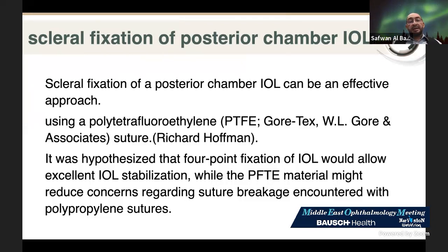And for this suture, I searched for the one who used it off-label, and the first one who published a few things around it was Professor Richard Hoffman. It was hypothesized that 4-point fixation of the IOL would allow excellent IOL stabilization, while the Gore-Tex material might reduce the concern regarding suture breakage encountered with a polypropylene suture.